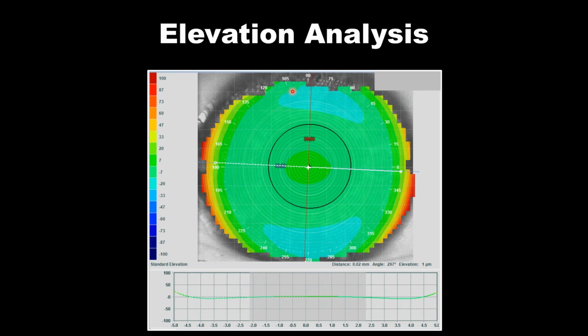So if we were to use a conventional single vision, spherical contact lens, it's going to land here across the hot contours, the high elevation. It's going to lift at 12 and 6 o'clock where we have the low elevation. This elevation map is the analysis that the EyeSpace software is going to use to interpret the appropriate contact lens for that eye.